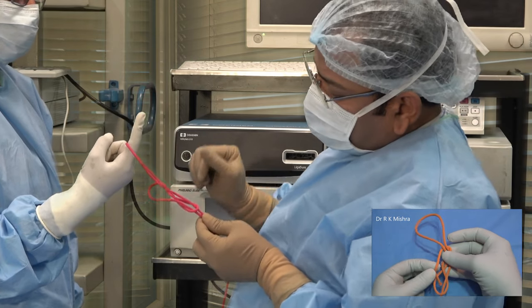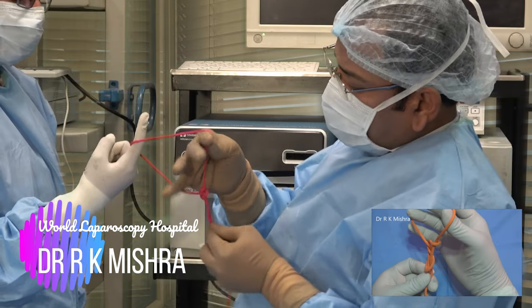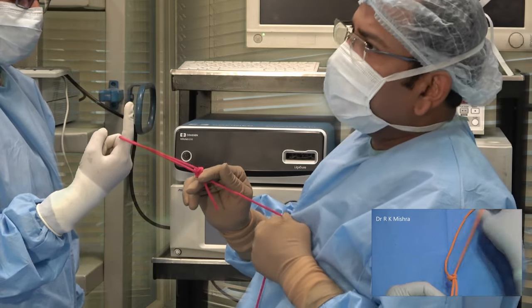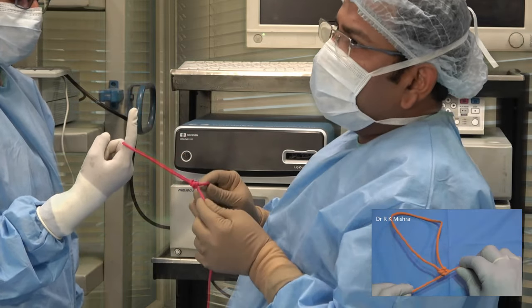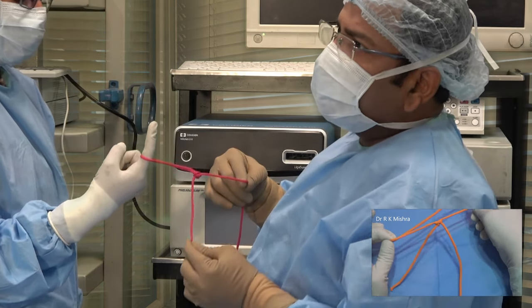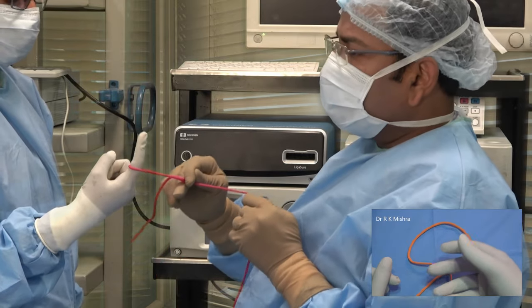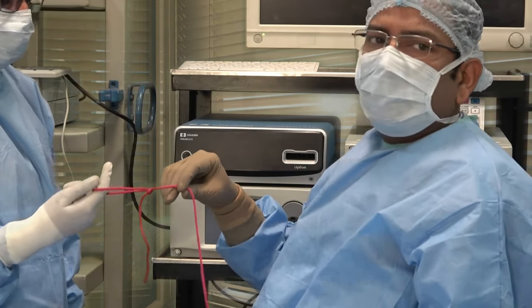After encircling both limbs, you will go to the first hitch and it will be over. This is a beautiful knot — you can slide it and wherever you want to lock it, just pull the tail and it gets locked. You can use it for your knotting purposes and you don't need a knot pusher.